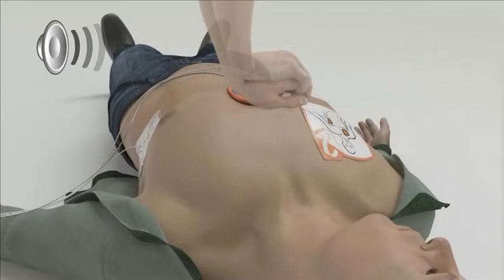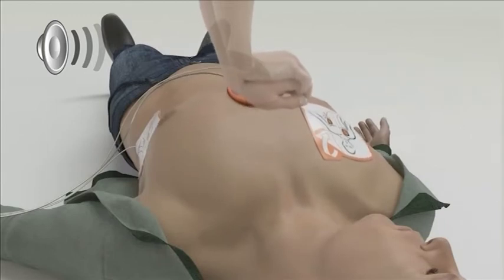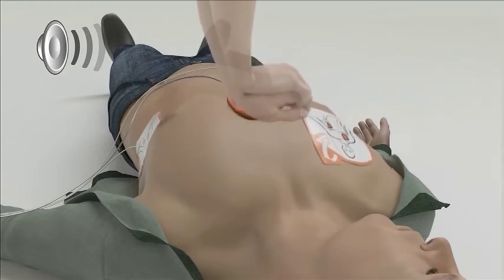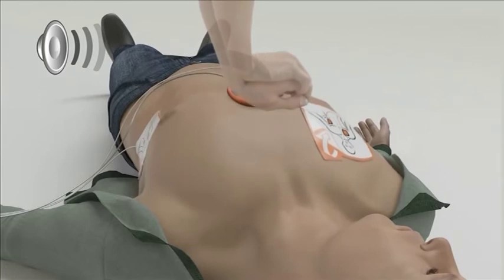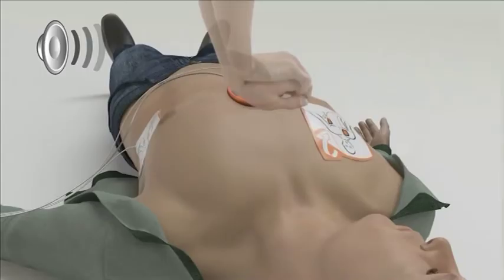Press the patient's chest down rapidly, 1/3 the depth of chest, then release. Give patient 30 rapid compressions and 2 breaths. Start CPR. Press harder and fully release. Stop compressions. Give breath. Give breath. Continue with compressions.